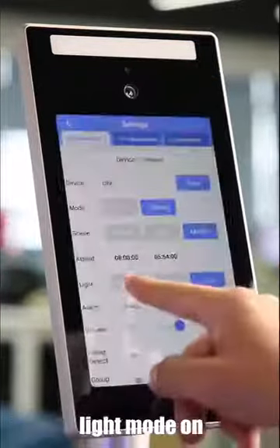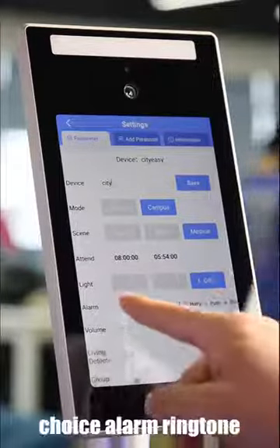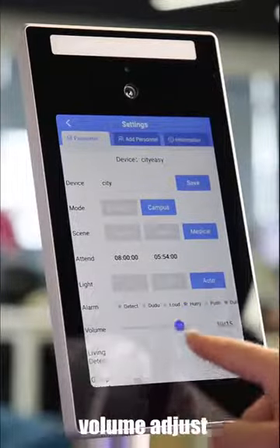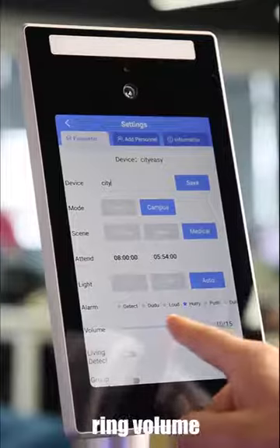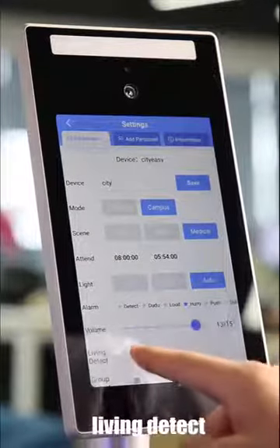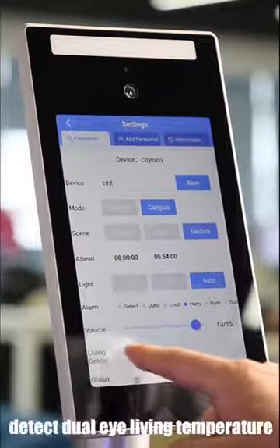Light mode on and off, auto choice. Alarm ring, tone, volume adjust, ring volume. Living detect — do a living detection.